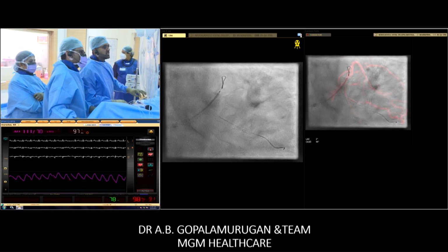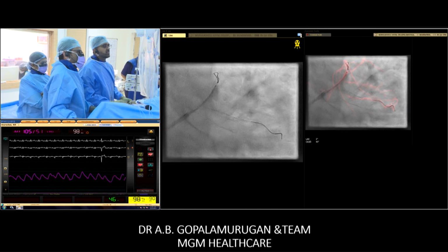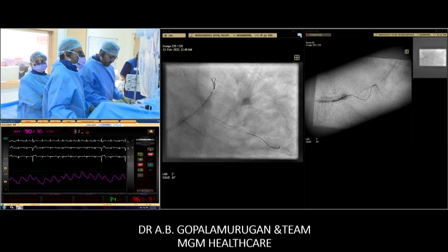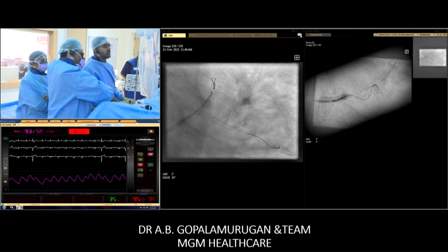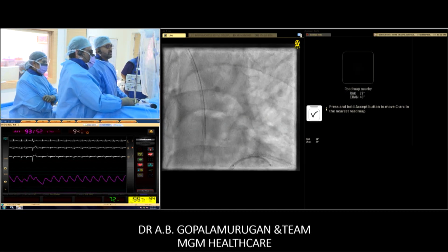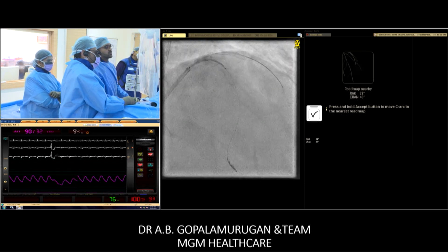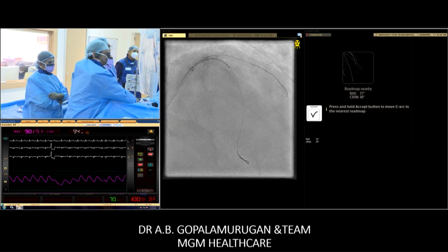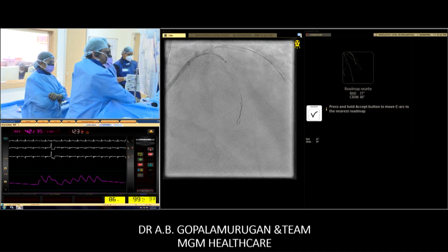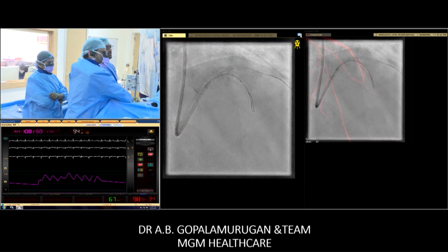I think in emergencies, semi-emergencies, it's reasonable to take, but for electives, it's best to take one step at a stage. Cranial, please. And again, Gopal's point is very right, if it is a 6 French and you are dealing with this two-stent strategy in the left main, 6 French won't allow. But if it is a small diagonal, LAD like the previous case they showed, yes, you could go with two small stents in 6 French as well. At the proximal left main, 2 stents simultaneously, 6 French will not be enough.